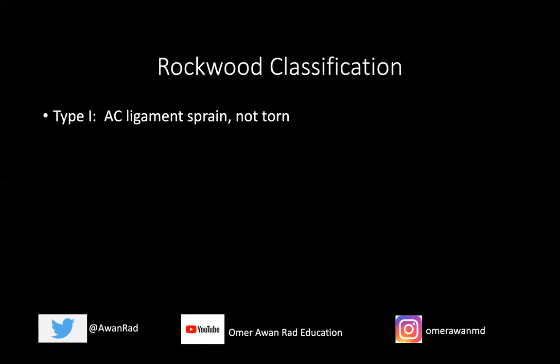A type one injury you will never diagnose on radiography because the x-ray is normal — the AC ligament is sprained but not torn. On MRI, you may see thickening and heterogeneous signal within the AC ligament suggesting a type one injury, but you would never call it on x-ray.